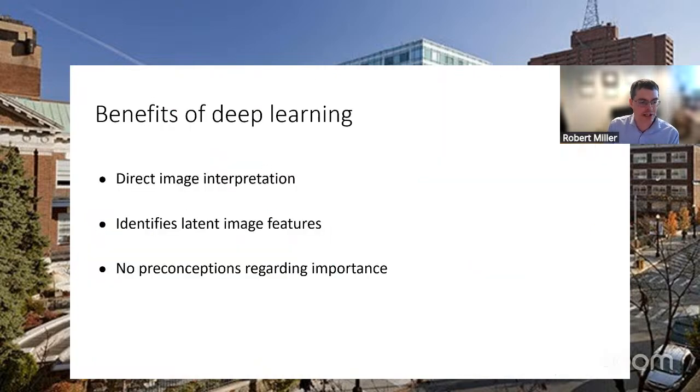Deep learning has several benefits. It has direct image interpretation, so you can just feed it an image and ask it what it thinks.